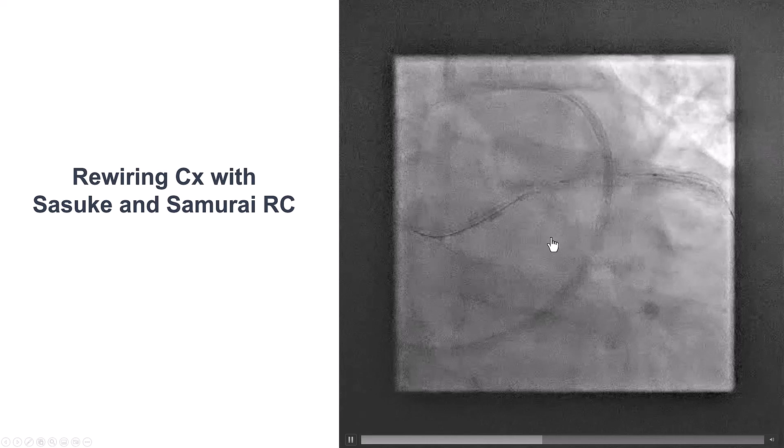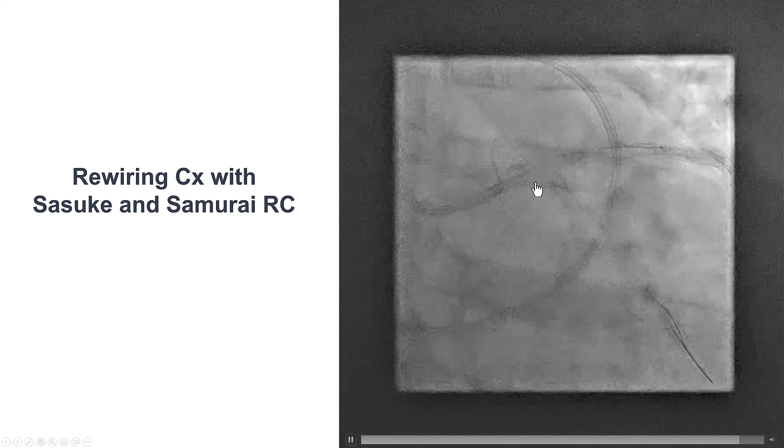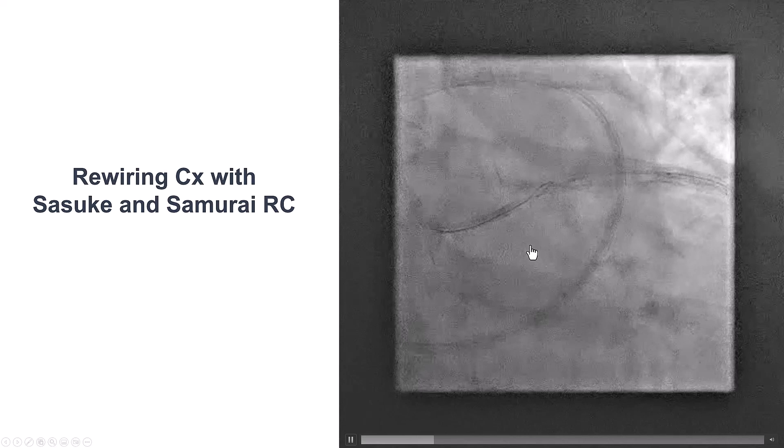The lesson is that whenever you have difficulty rewiring into a side branch after stenting the main vessel, one option is to use a dual lumen microcatheter. Another one is different wires and different angles, such as a polymer-coated wire. And this was the final kissing balloon inflation into the left main.